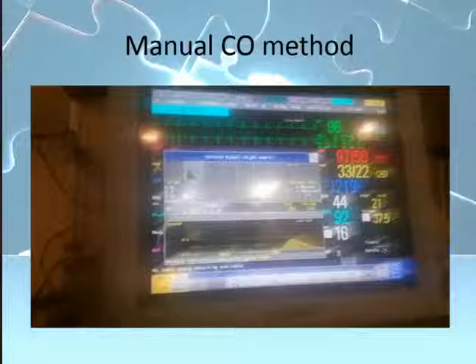And so if your square wave test is overdampened or underdampened, you know that you need to do some troubleshooting, like check for air bubbles, make sure the length of your tubing is appropriate, make sure that your pressure bag is fully inflated to the 300 millimeters of mercury.